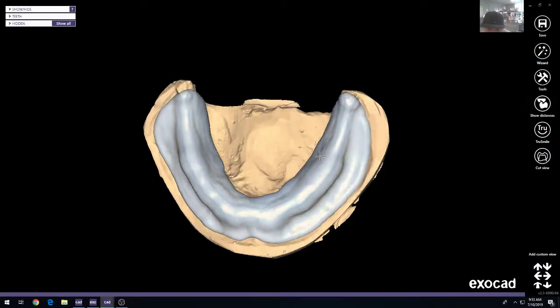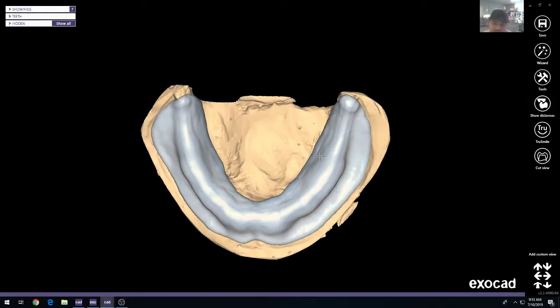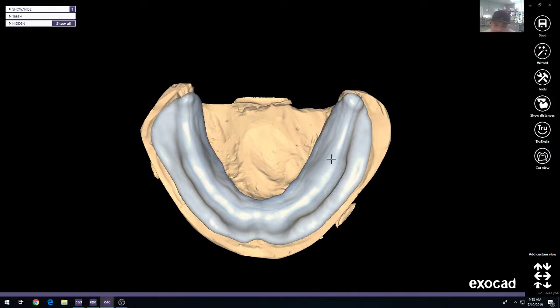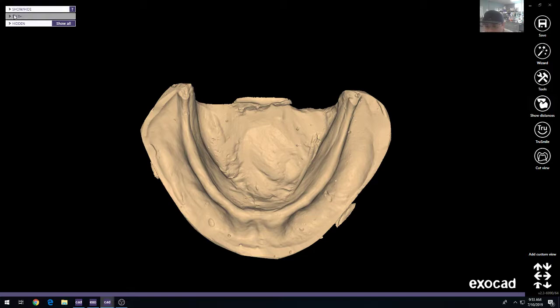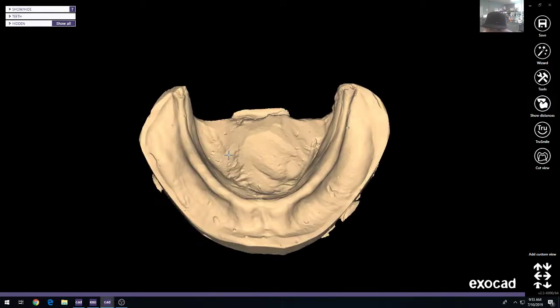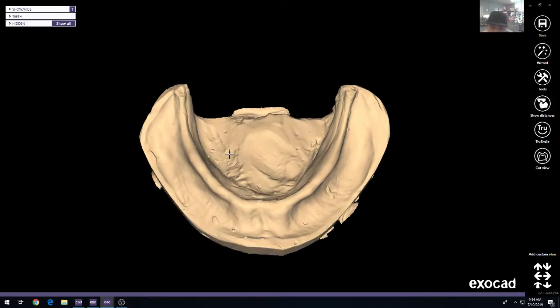Hey everyone, this is Josh. I just wanted to go over a basic workflow inside of ExoCAD where you can make a base plate for an edentulous arch. That's going to be using the Bitesplint module.